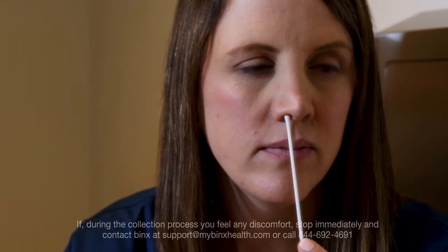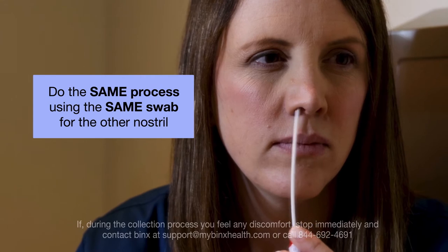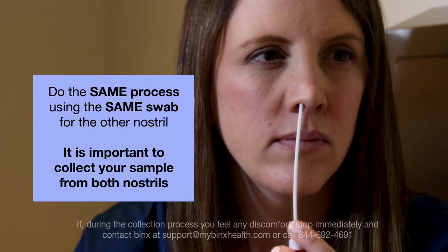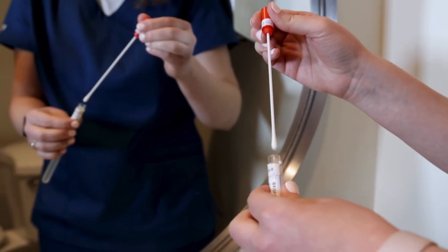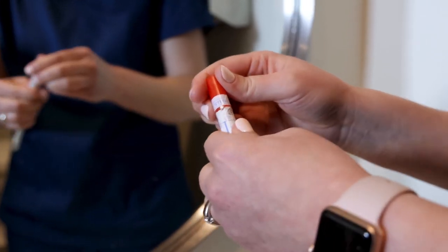Once you've completed these steps with the first nostril, do the same process using the same swab for the other nostril. It is important to collect your sample from both nostrils. When you have finished collecting your sample, carefully place the swab tip first — without touching the swab tip with your hands — into the swab tube and close the tube tightly until you hear a click.